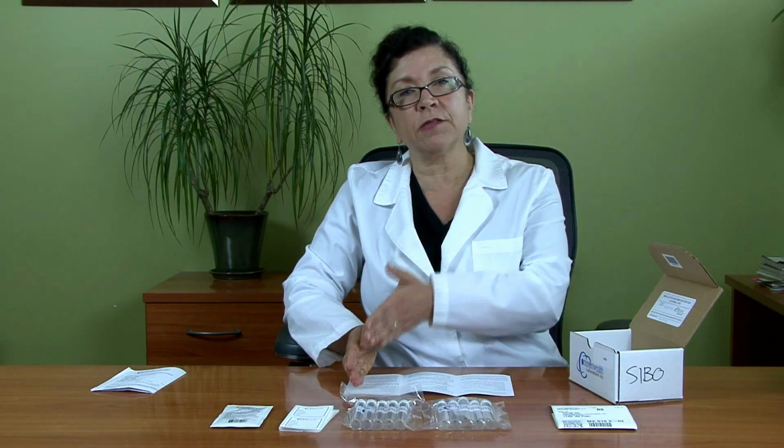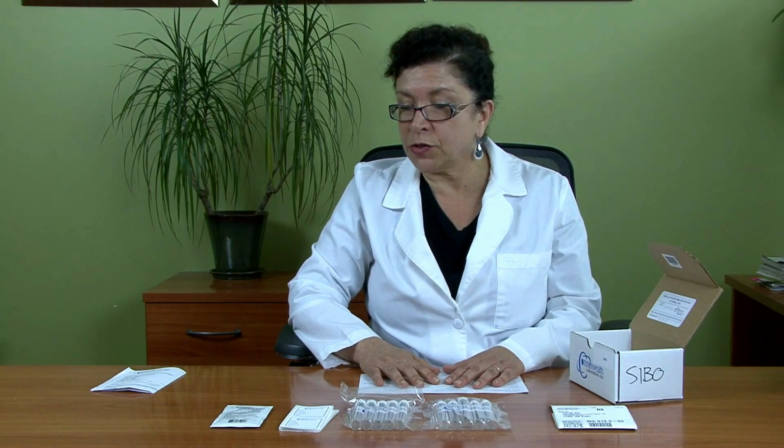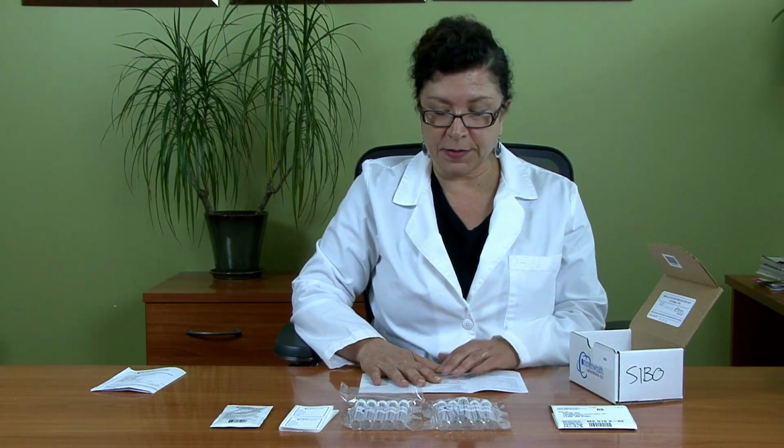So that would be the next morning when you get up. So when you get up the next morning, you can drink water, and that's it. No other food, and remember, you can't smoke. So let's talk about how to actually perform the test.